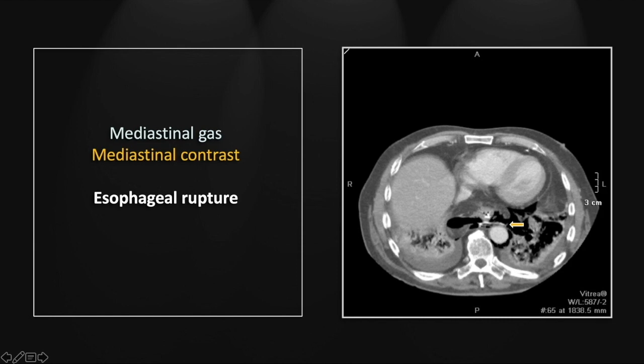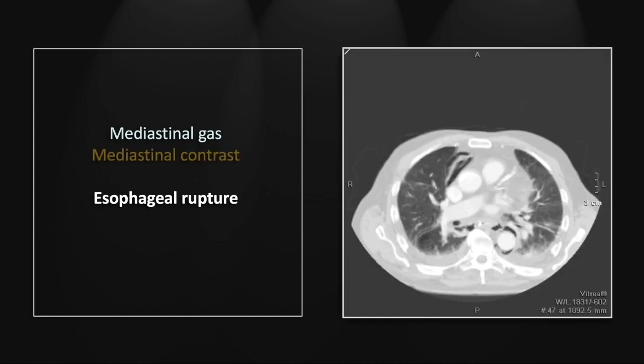It is worth noting that in these patients, the esophageal lacerations related to retching and vomiting will tend to have fairly extensive mediastinal gas, as you see in this case. In traumatic esophageal ruptures, the mediastinal soft tissues tend to knit together tightly and prevent the extensive pneumomediastinum that you see here.